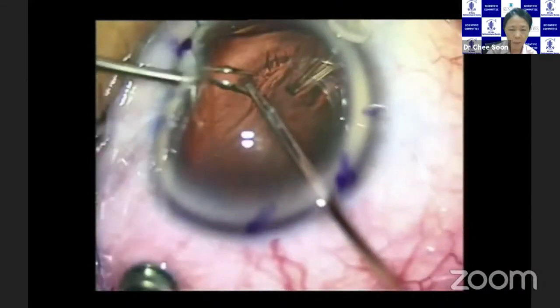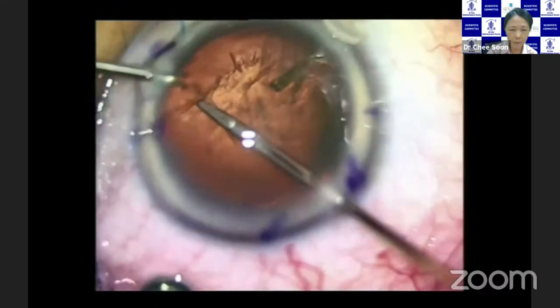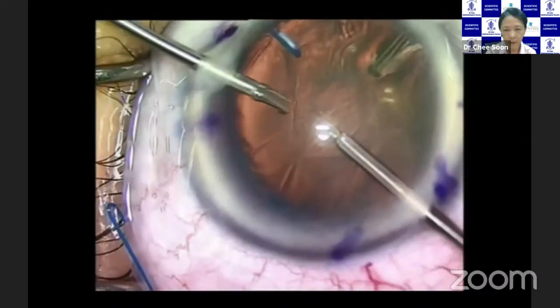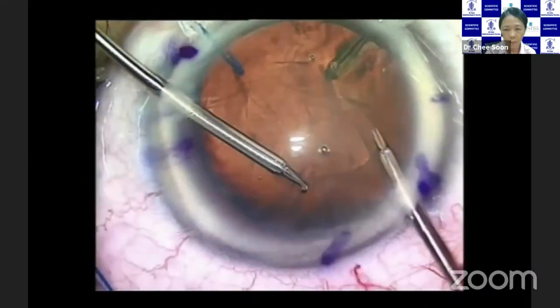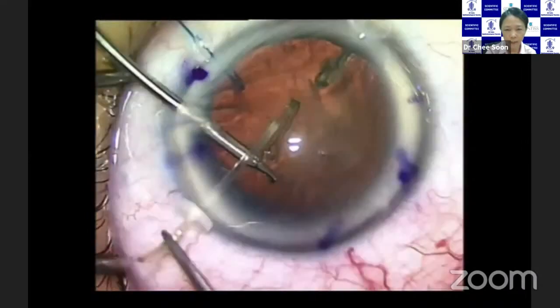And with a bimanual technique, you want to use forceps that are not sharp. So I started with the capsulorhexis forceps. I then continue with two MST micrograspers. And as you go along, you can start to support the capsule, the whole lens, at the capsulorhexis.